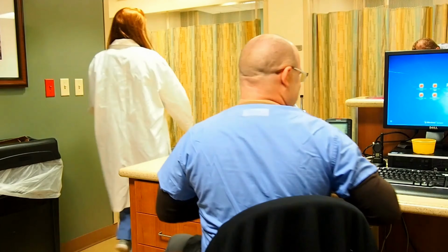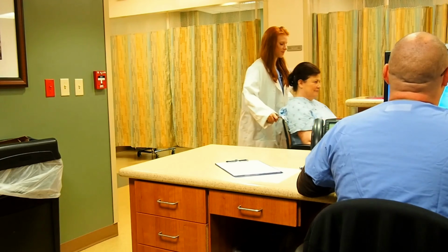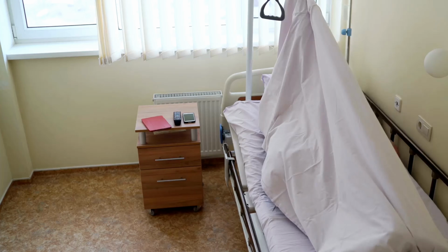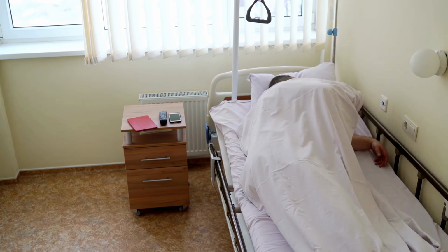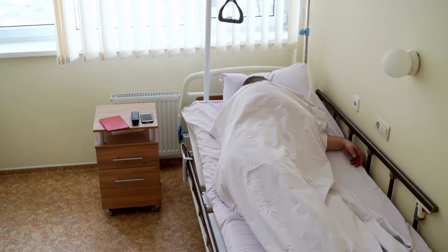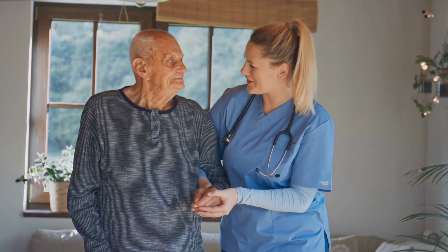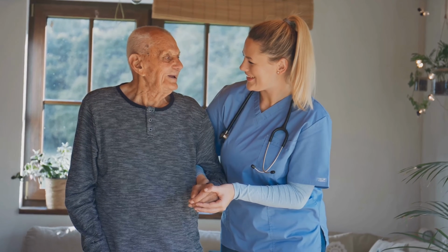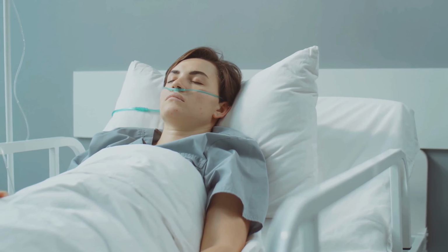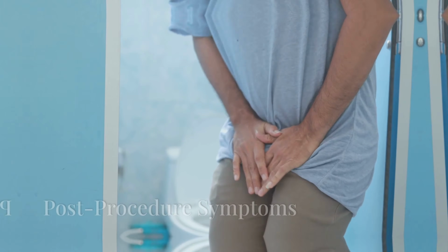After a flexible cystoscopy, if everything goes as planned, the patient can go home immediately. They can resume work and normal activities when they feel ready. After a rigid cystoscopy, the patient can be discharged home after recovering from anesthesia and once able to urinate. The patient must have someone to drive them home and stay with them for at least 24 hours if they had spinal or general anesthesia. They must be advised to avoid alcohol, driving, and operating heavy machinery for 24 hours.